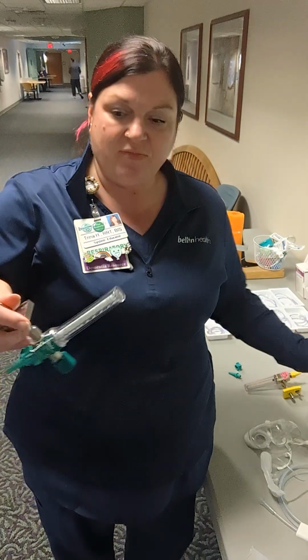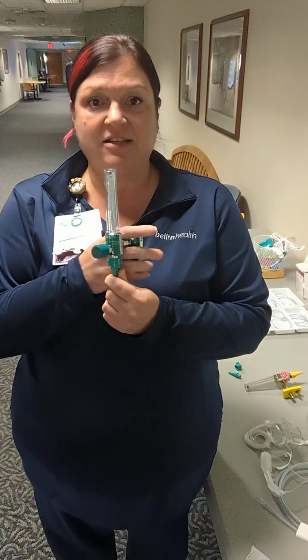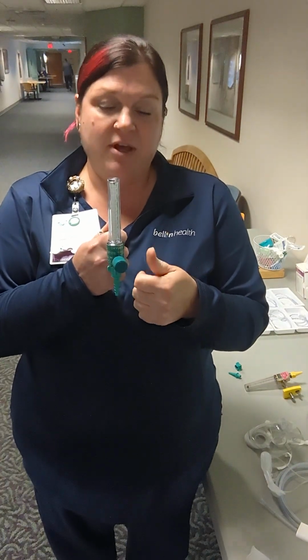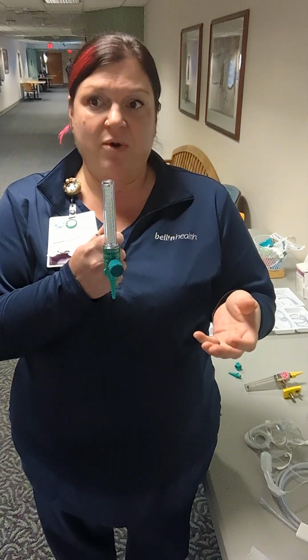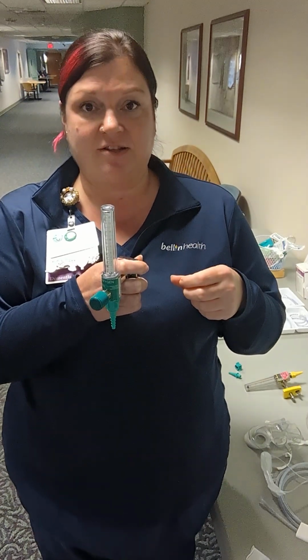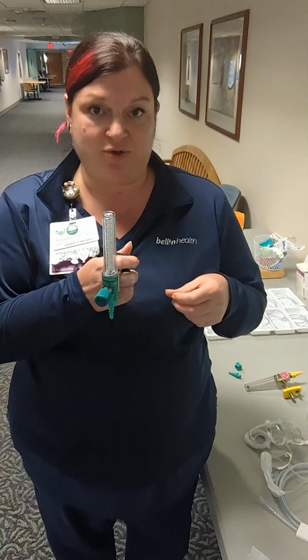Whereas if I'm using this gas, so this is oxygen, every time I open up the valve, we get more and more flow. With more flow of oxygen comes higher concentration of FiO2.